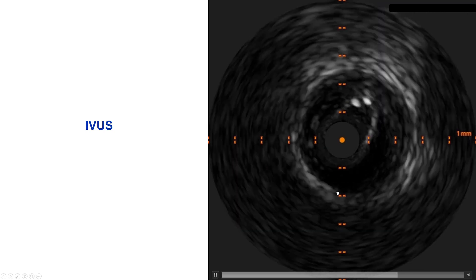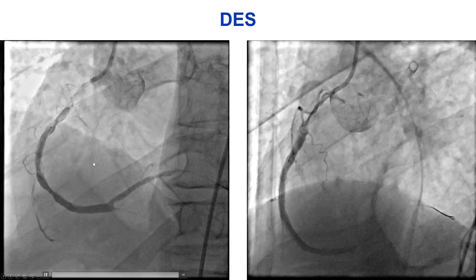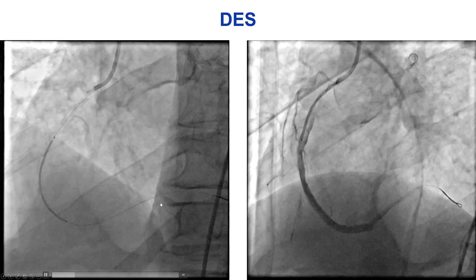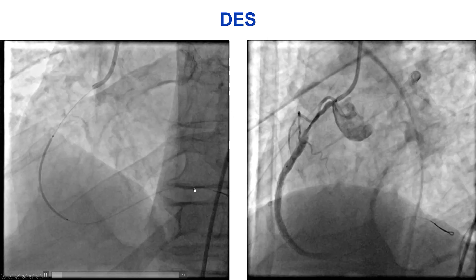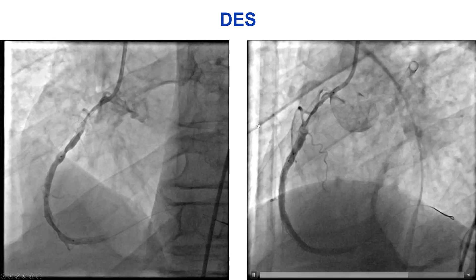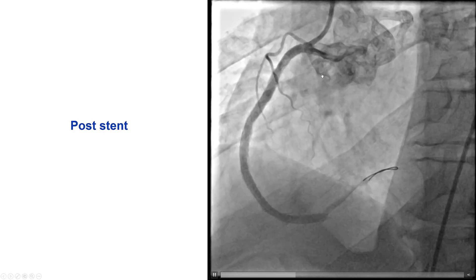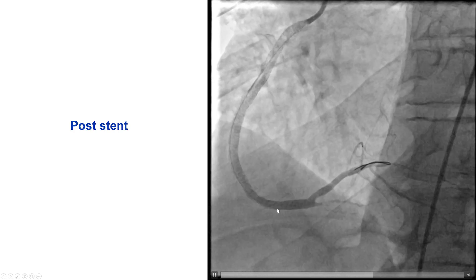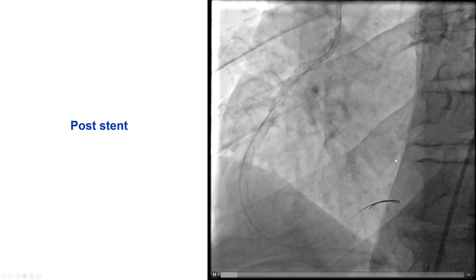This is now a 4.0 millimeter vessel. Wiring goes very easily into the posterolateral using a workhorse guidewire, and then we place two drug-eluting stents from the distal RCA all the way to the ostium of the right coronary artery, and this provided a nice result. We do have TIMI flow into the posterolateral.